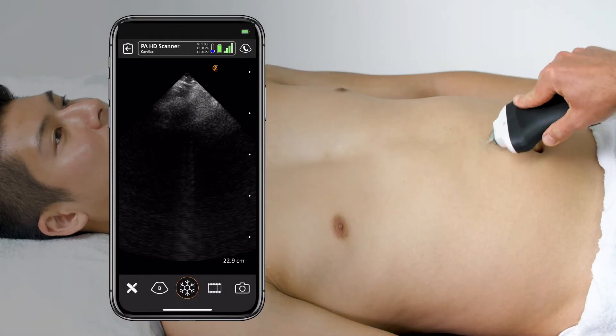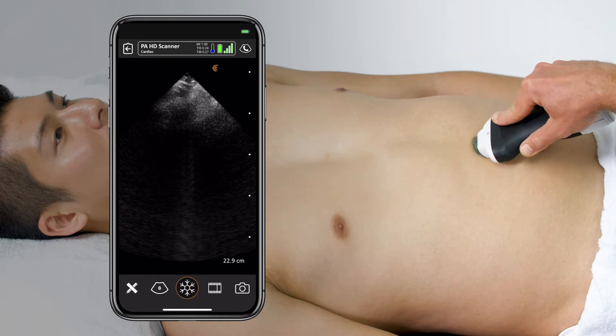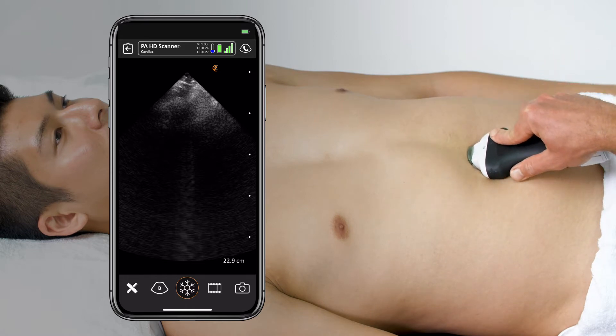To perform the scan, place the transducer above the umbilicus but below the xiphoid process, and aim it gently towards the left shoulder, parallel to the floor.